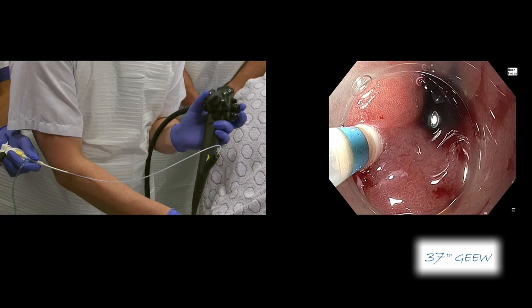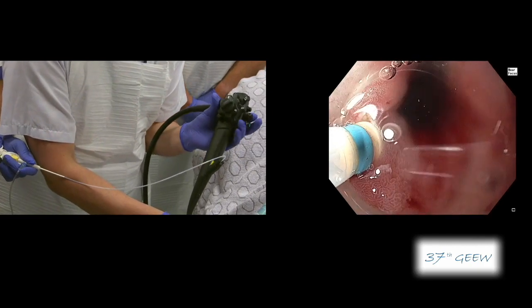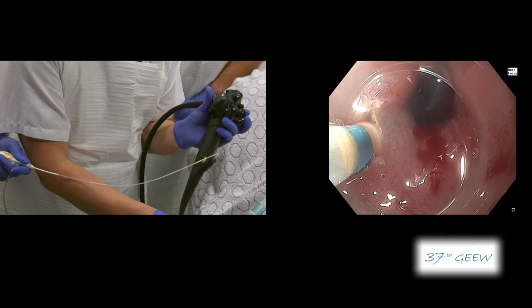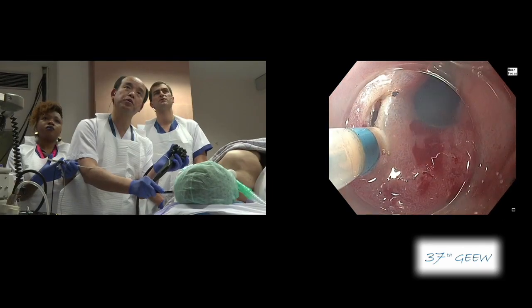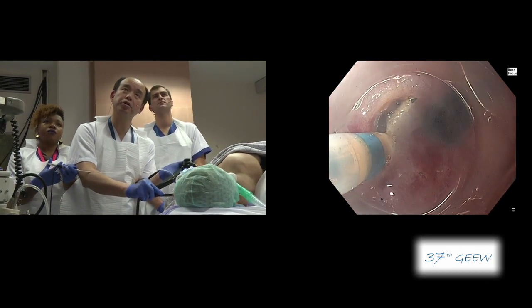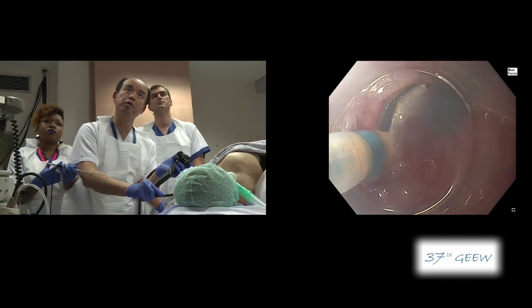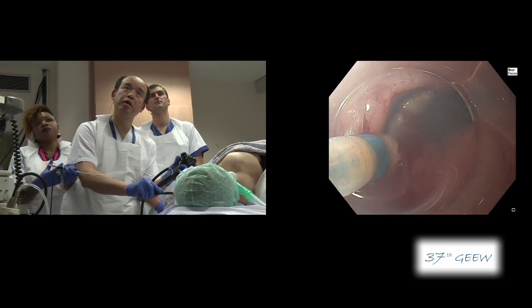Now I have made a tiny hole and, using a down-angle carefully, I cut the mucosa. It is very difficult to control but still possible. Just twisting the endoscope and using a down-angle — a little bit tricky.